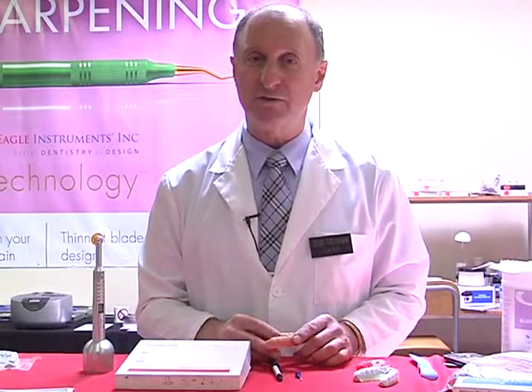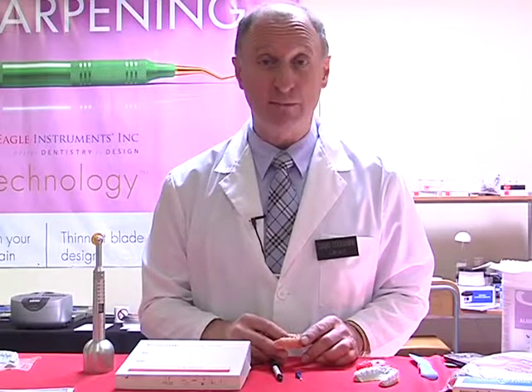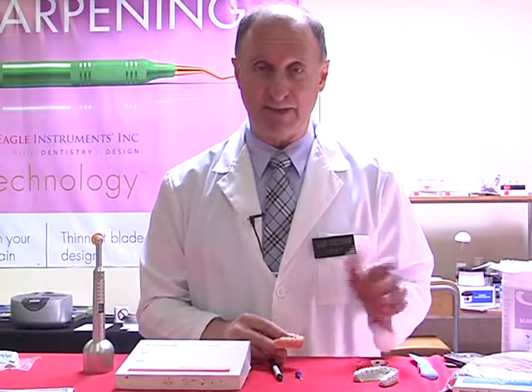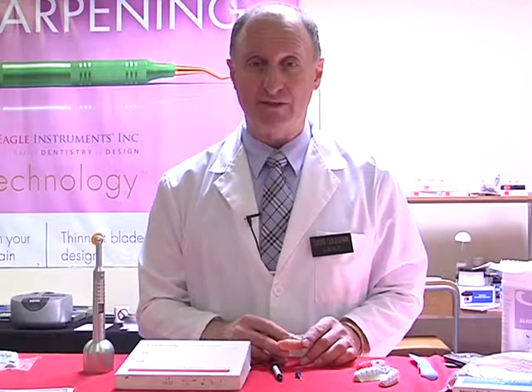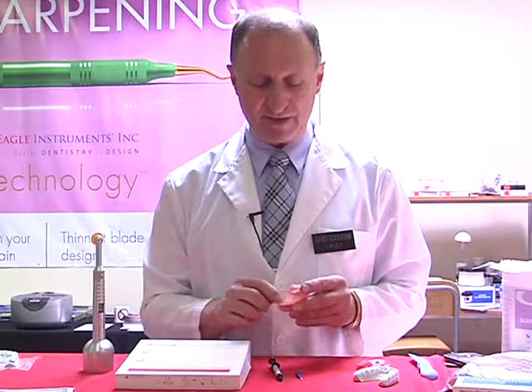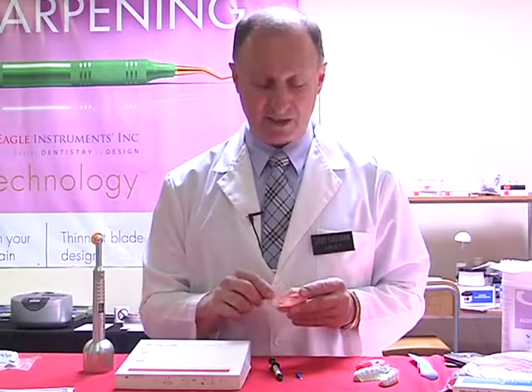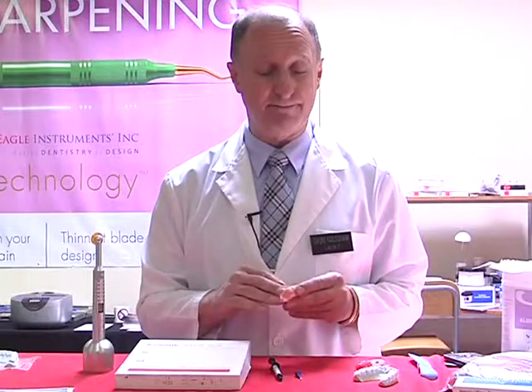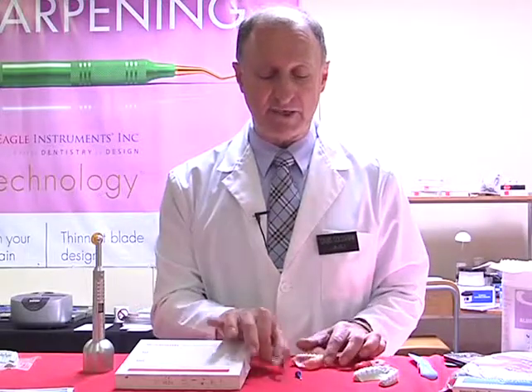We will pick up an indelible pen. That can be a Sharpie style of pen, which you can pick up at any of the major stores out there. Make sure it's a fine tip. Write the patient information, allergic reaction, name, in a convenient area out of the way. Let it dry. Once it's dried, we're going to take hold of this kit.